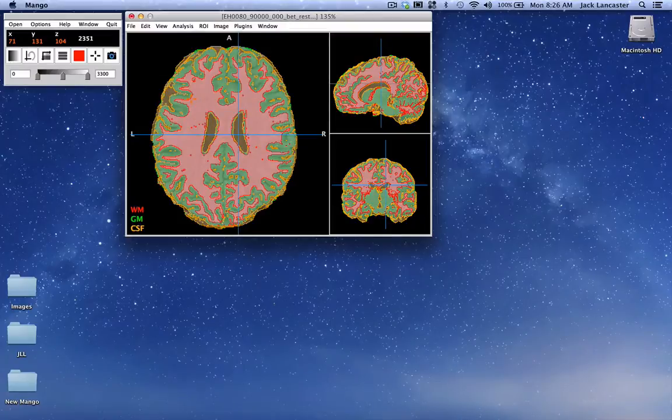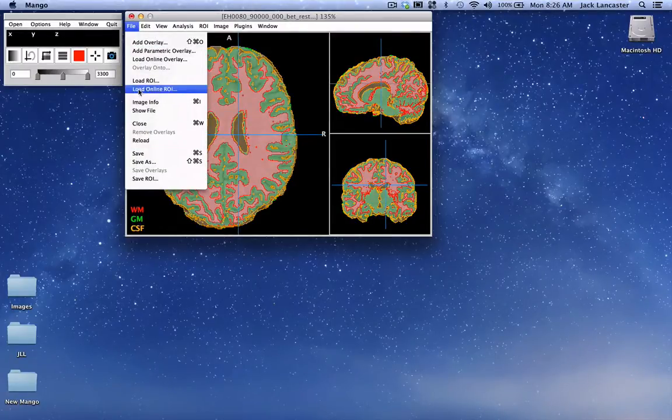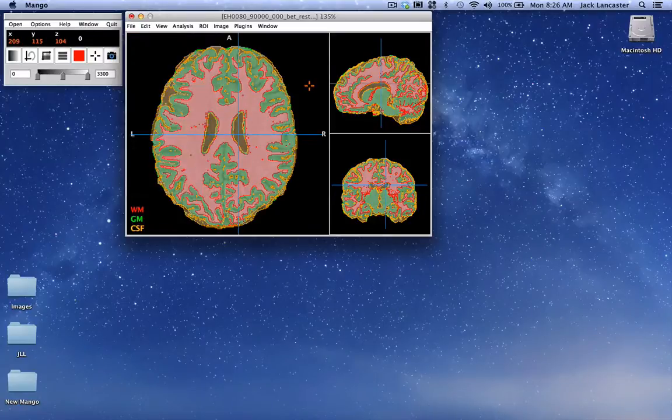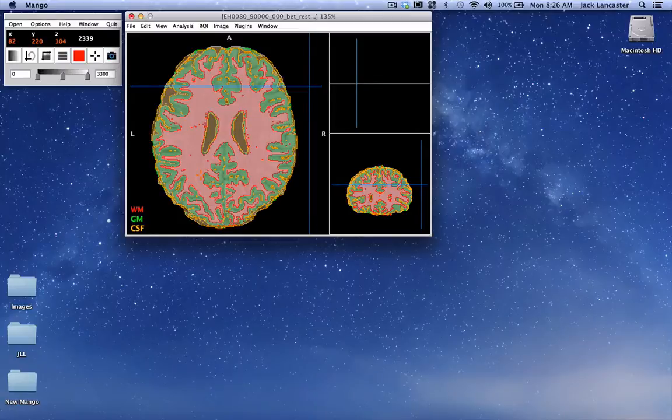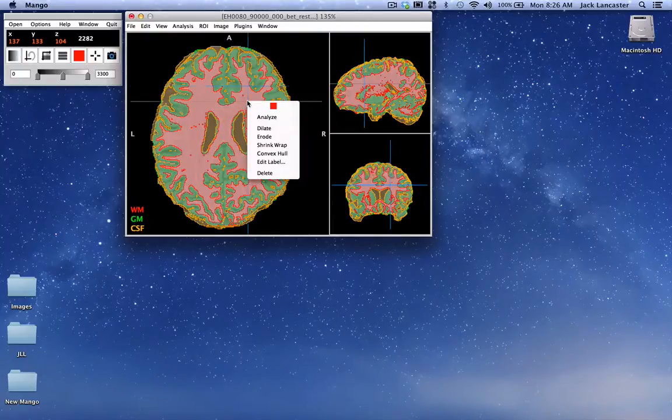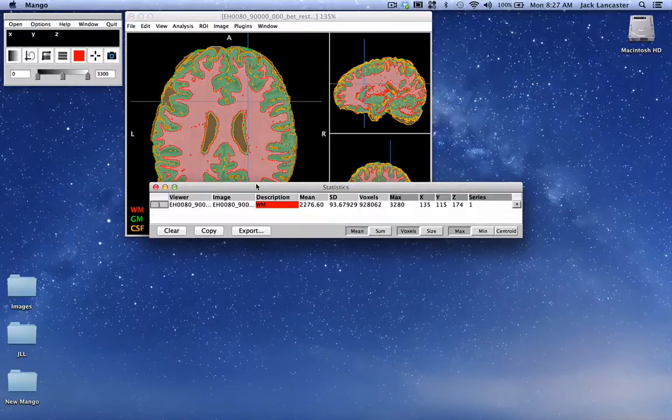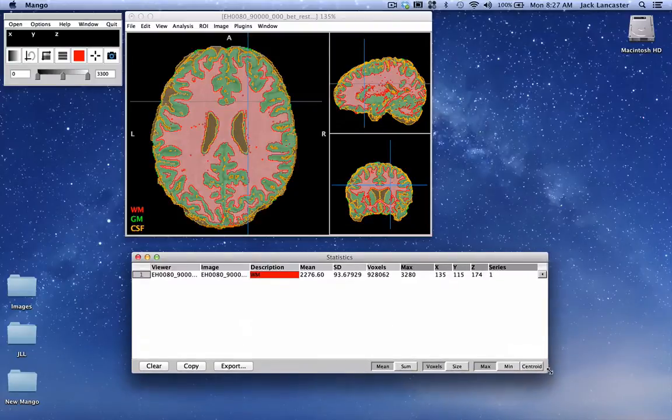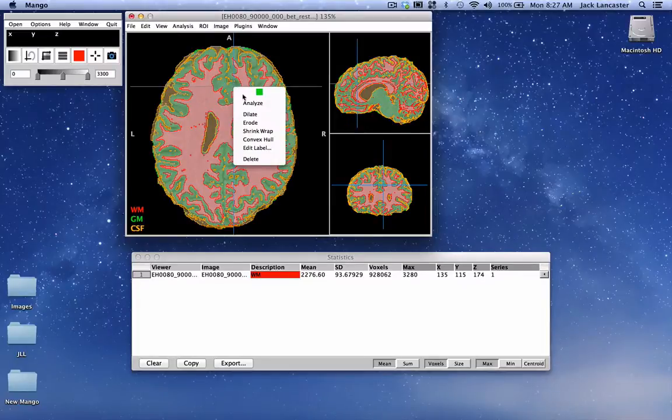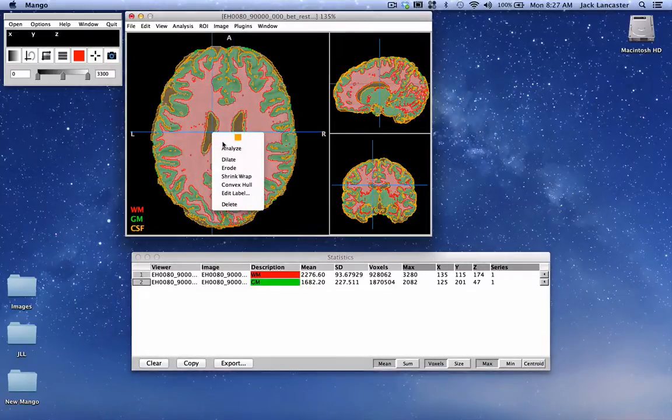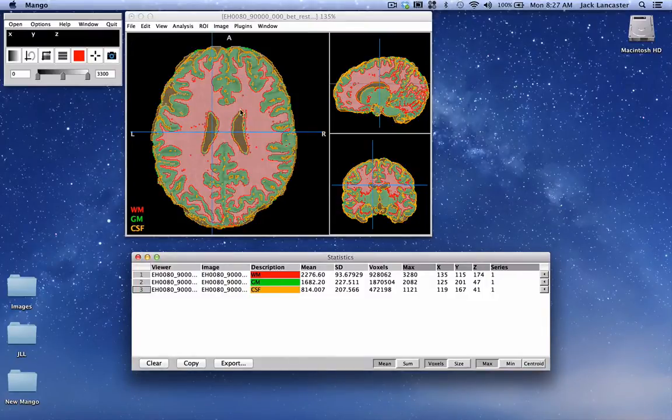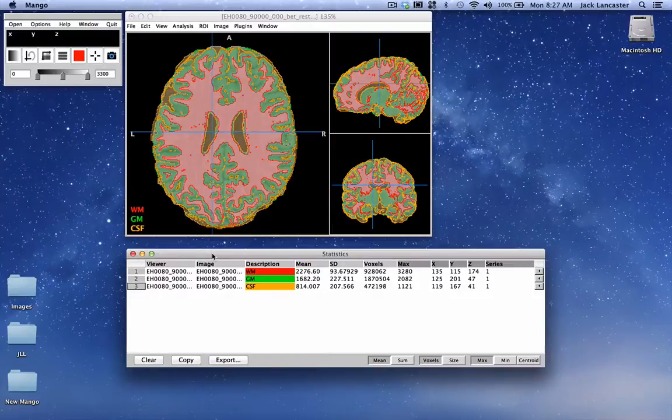Now we have more meaningful labels by tissue type. If you save this file as an ROI and reload it back as an ROI, it'll have these label names corresponding to the colored regions you see here. We can also use this pop-up menu to do what's called fast analysis. If I click in here and analyze, I can analyze the region where I'm pointing. I can analyze it by just pointing and clicking. Now certainly the old style was to highlight it first then analyze it, or highlight everything and get it at once. That's still useful as you'll see in a moment, but here being able to point and then analyze is a nice feature.